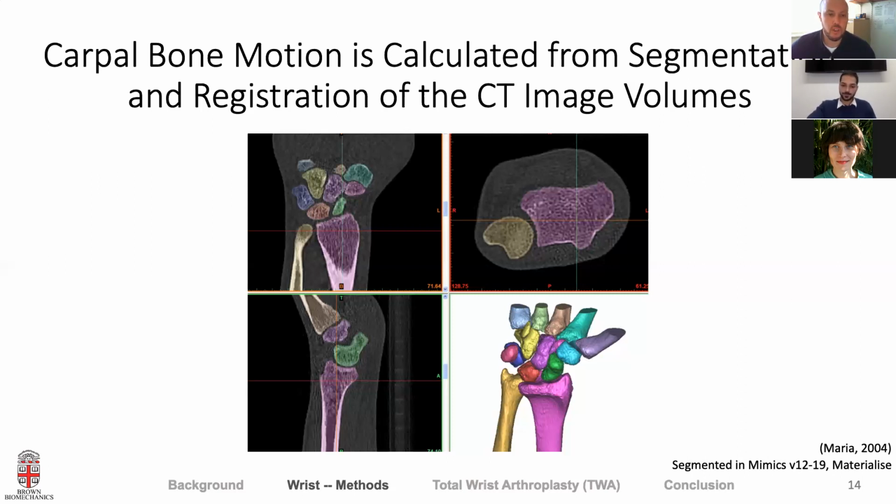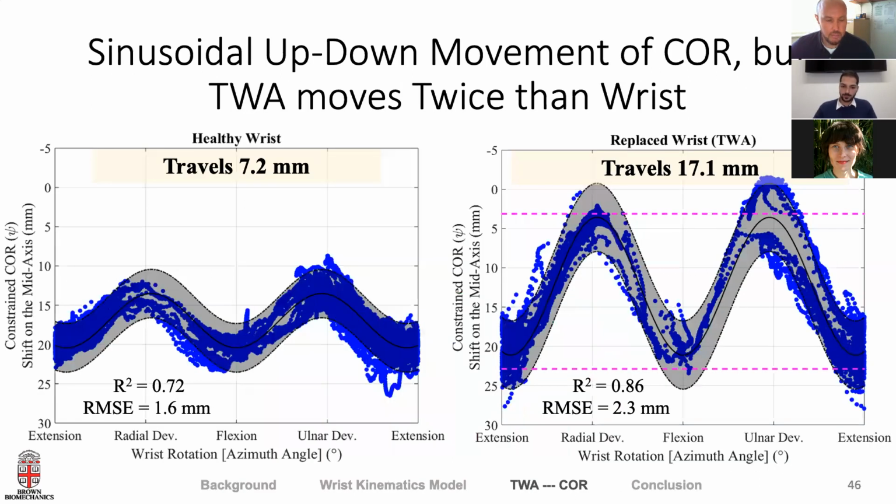When looking at some of the results, it appeared that there were a range of different helical axes based on the type of movement you were doing. Is it possible for an implant to accommodate these very different positions and orientations of those helical axes within the articulations? Or is it more about trying to find a compromise between them that works sort of okay?